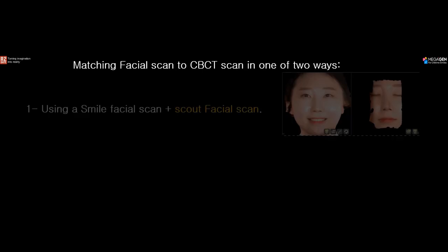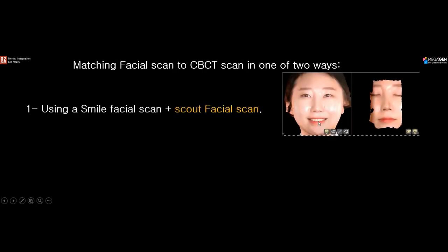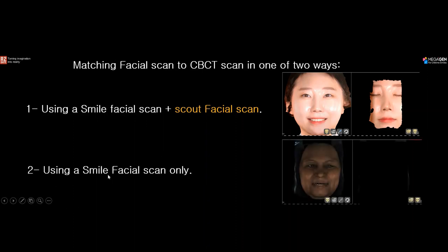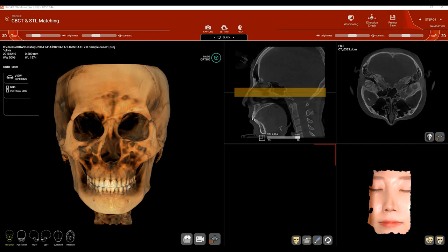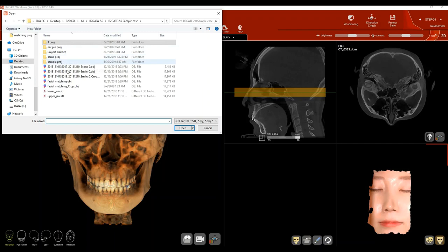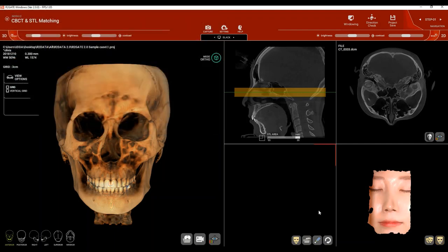To match a facial scan to the CBCT, there are two approaches. Number one: using a smile scan plus a scout facial scan — the scout facial scan is the small scan on the right side, and the full smile scan is on the left. Or, number two: use only a smile facial scan, as in this case. To match using a scout scan, click the icon on the lower right that says 'import scout scan,' import from the patient folder, then import the smile scan using the 'import smile facial scan' icon.